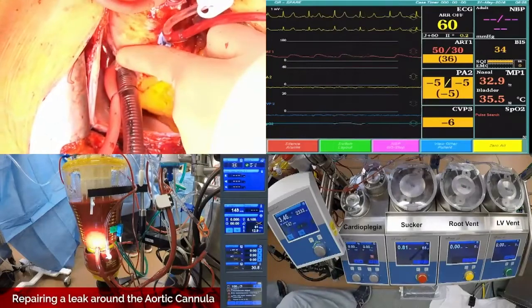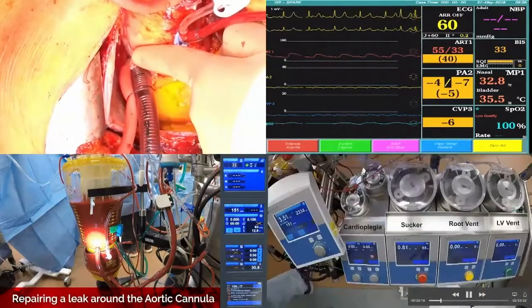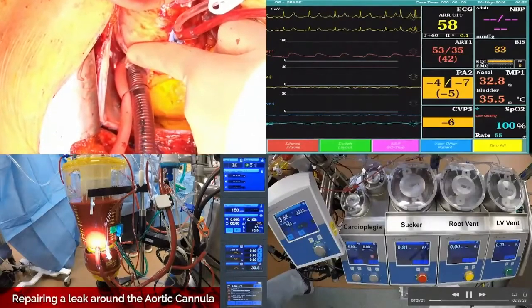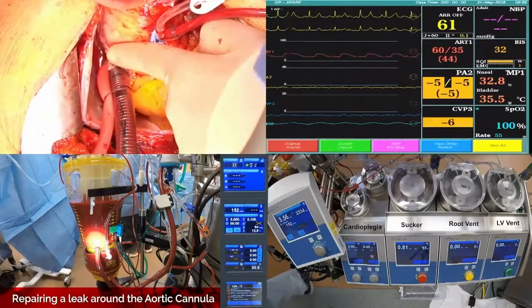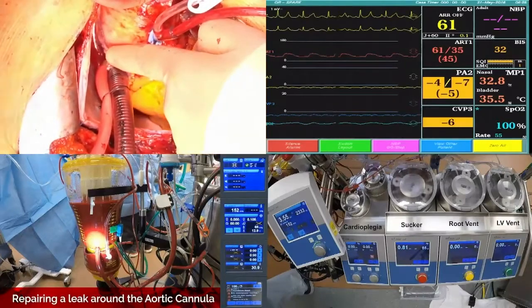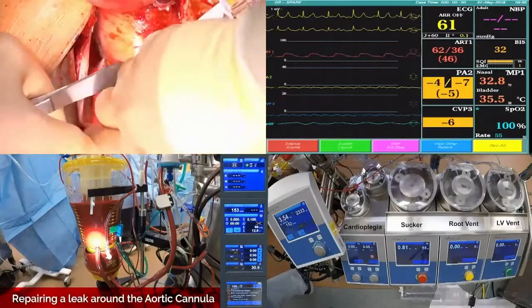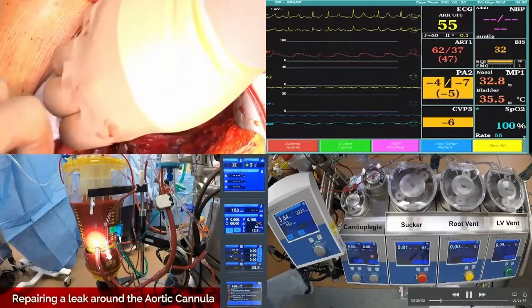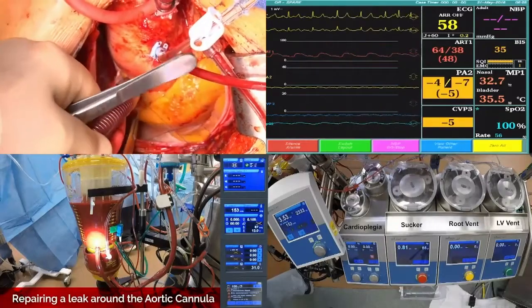But anyway, at 24:30, I have a question for you because it looks like we're on pump, and then you're repairing what might be a leak around that aortic cannula. That's the venous cannula there. Yeah, that's the venous too. Well, I know, but where are we on this? Are we at 24:50? 24 minutes? I'm sorry, 25:30. Yeah, so you're sucking a bunch of air.